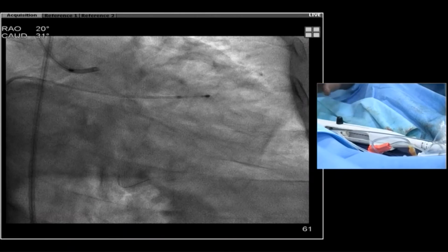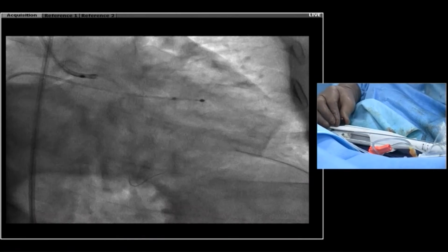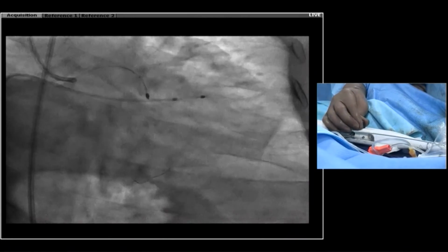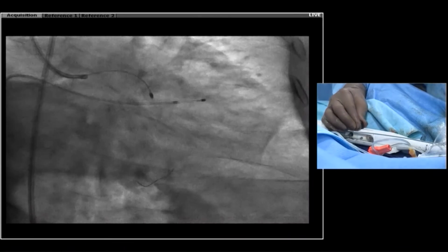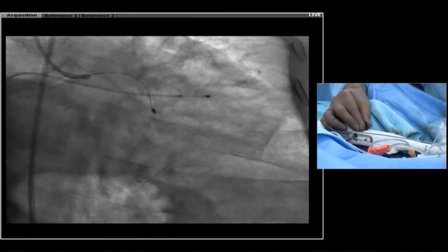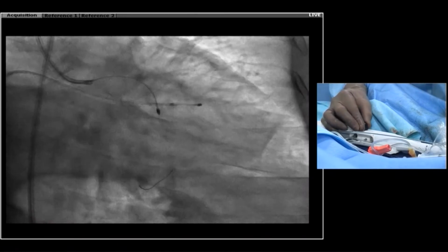Okay. Some jump. Already you see resistance up there. So which speed do you have now? 180. Yeah, that's fine. 185,000 RPM.